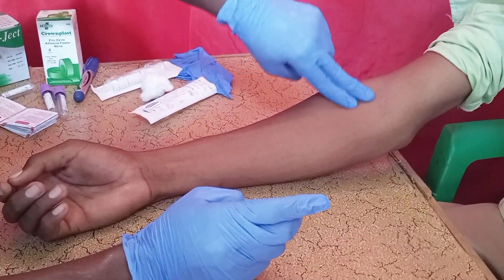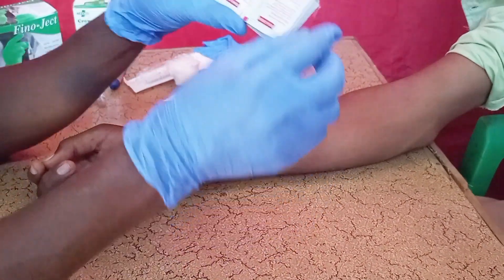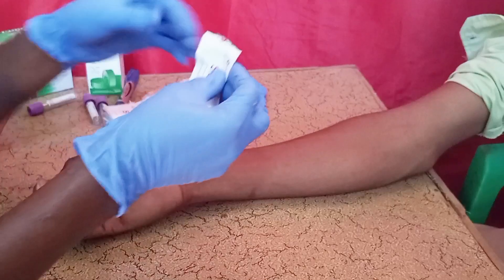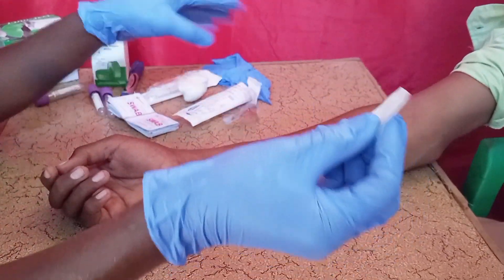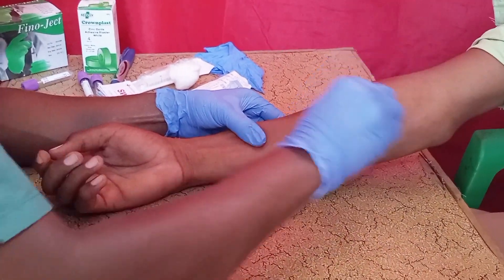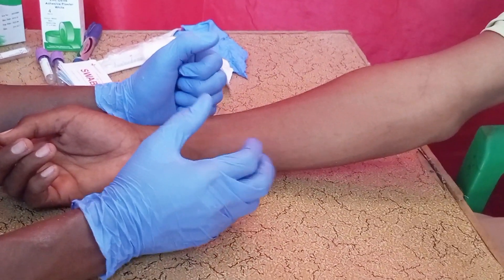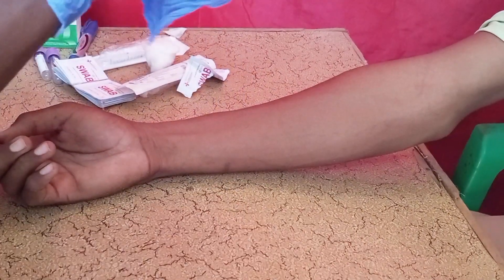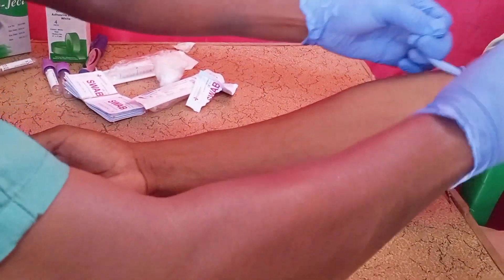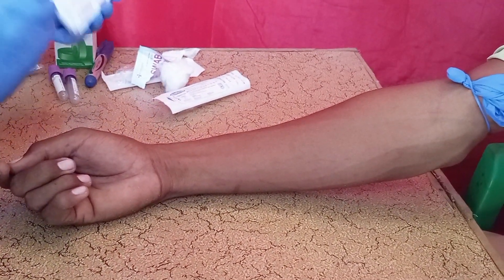You have to select the best and suitable vein to draw the blood. First, apply a tourniquet, then apply an alcohol swab around the vein gently. Apply the alcohol swab, then allow the skin to dry before you start taking the blood.